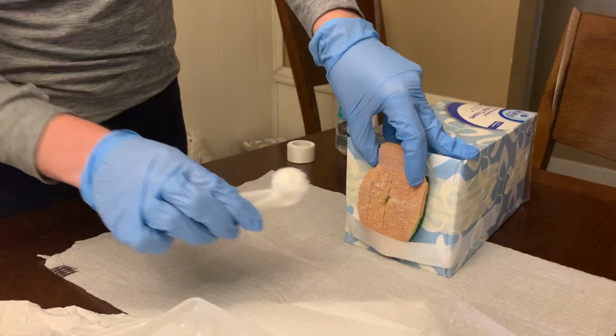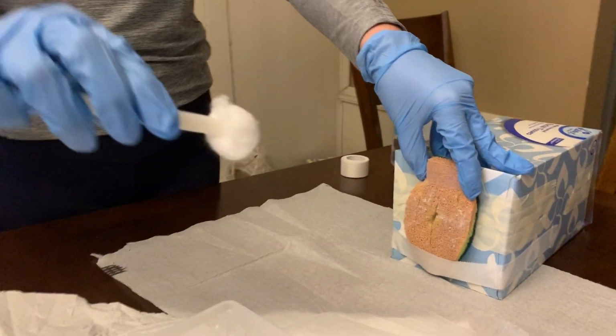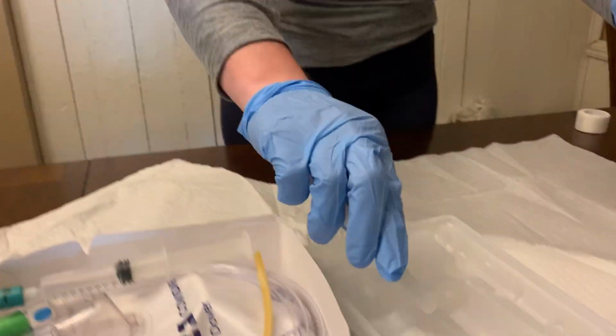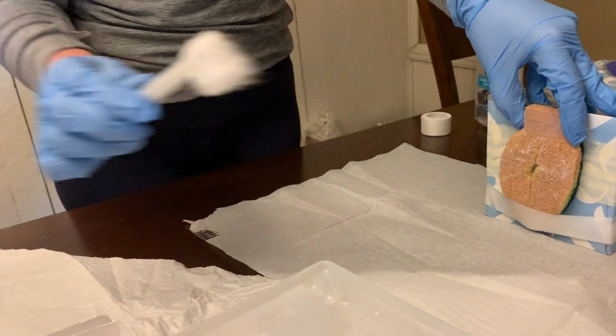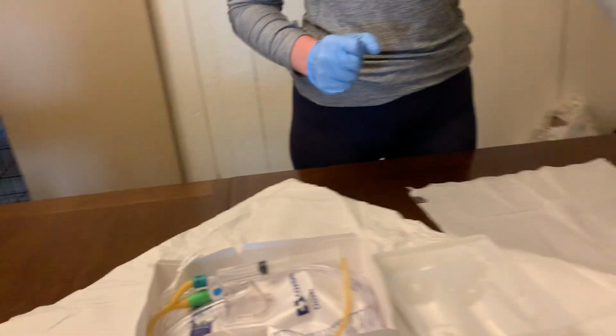I will take another cotton ball and clean top to bottom on the other side. I will take a third cotton ball and clean down the middle, top to bottom again. And then I'm going to clean the meatus with one more cotton ball. I'm just going to do one circular motion around it without crossing over the path that I made. Okay, so I can now toss my forceps as well.